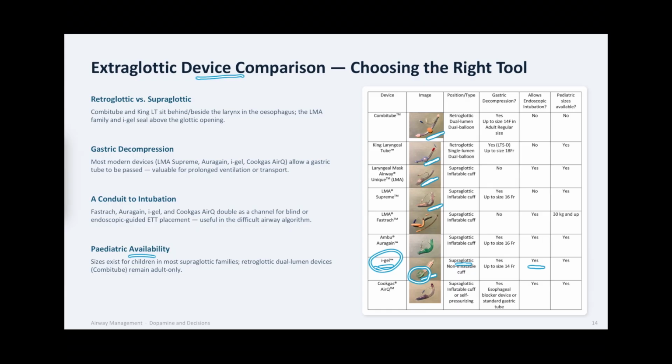Let's summarize this section. Successful airway management starts with simple interventions. Position the patient correctly, using the head tilt and chin lift or the jaw thrust maneuvers when appropriate. Insert airway adjuncts when indicated. Master bag valve mask ventilation because oxygenation always comes before intubation. Pre-oxygenate thoroughly, use apneic oxygenation whenever possible, and never hesitate to use a supraglottic airway if oxygenation is becoming difficult. These basic techniques form the foundation of every successful airway intervention.